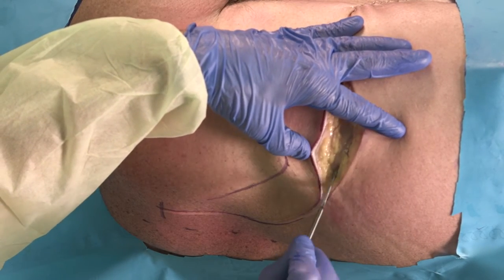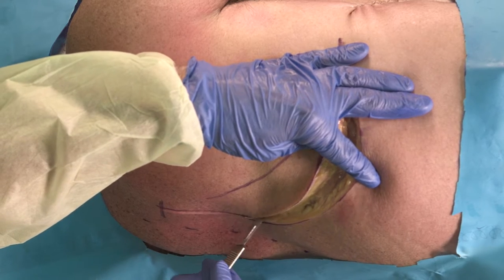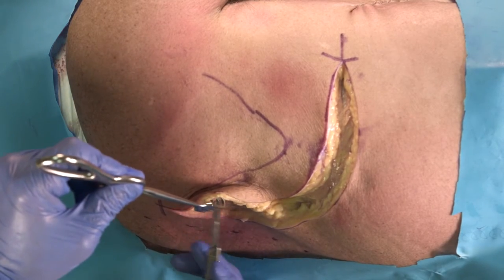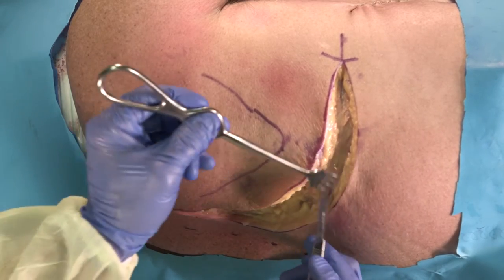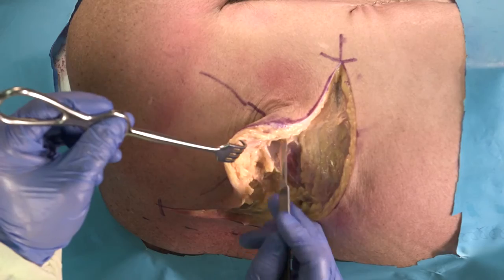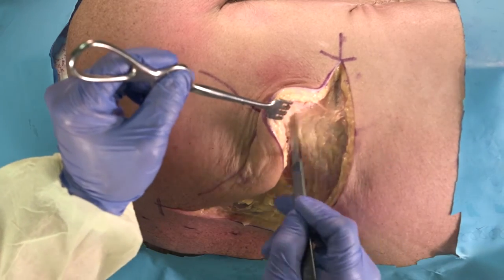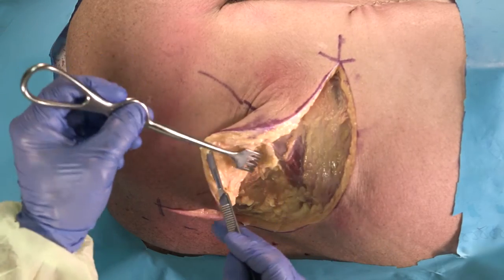Subcutaneous bleeding in these areas can be significant and hemostasis should be addressed with electrocautery. Our goal here is to get down through the skin and subcutaneous tissue into the fascia overlying the musculature. With the posterior lateral thoracotomy, we are looking for the triangle of auscultation, especially if using the muscle sparing technique shown here. The fascia is elevated, and at the end of the procedure, this is tacked down with a large absorbable suture to minimize seroma formation. A drain is not typically necessary. The fascia is elevated only as needed for the fracture and injury pattern; in this instance, we'll create a large field to improve visualization.